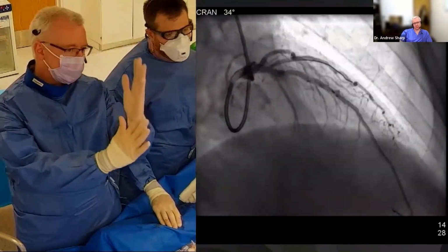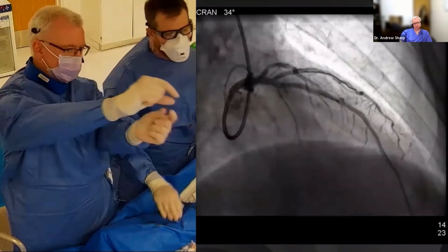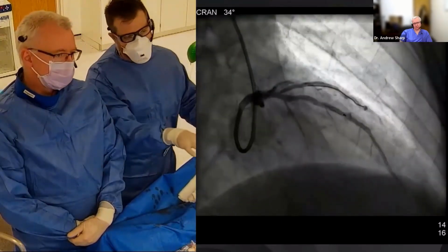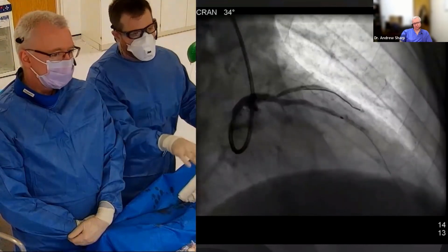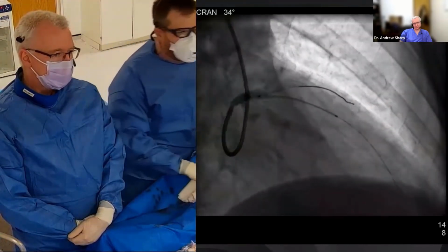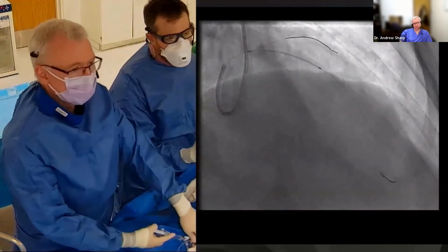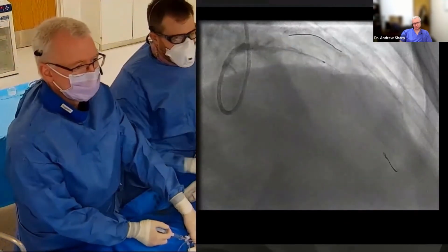What's your aim for the distal edge of the stent in relationship to that ectatic segment? Well, if we're looking at the IVUS, I'm not too worried about that ectatic segment, because the IVUS was telling us we had relatively normal vessel proximal to it. Yep. So I'm okay with that. You just stretch a normal bit. Yeah, I think it will look fine. Yes, there's going to be an ectatic bit. There's nothing we can do about that.